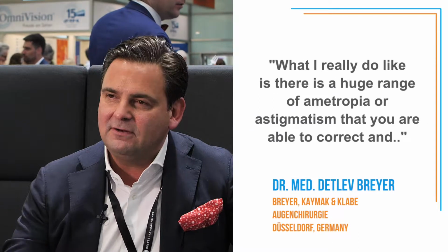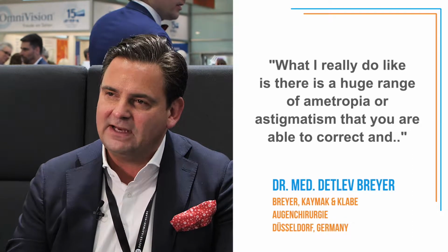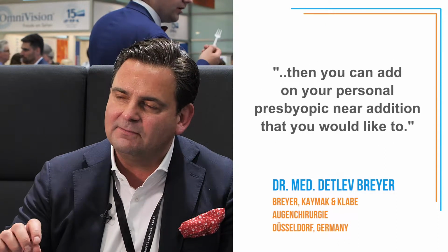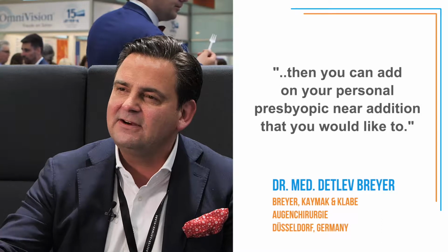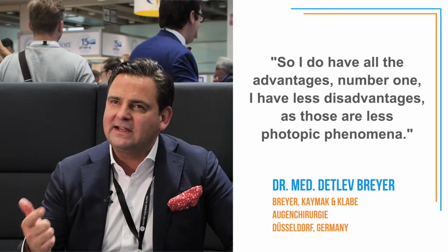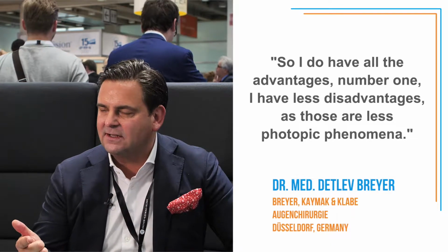What I really do like is that there is a huge range of ametropia or astigmatism you're able to correct, and then you can add on the personal presbyopic near addition you like to. So I do have all the advantages. Number one, I have fewer disadvantages, as there are fewer photopic phenomena.